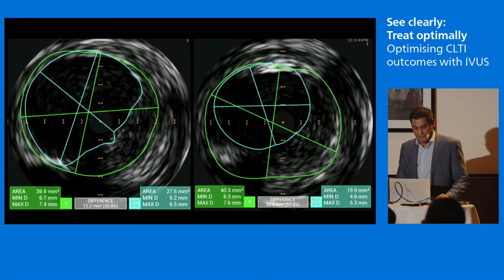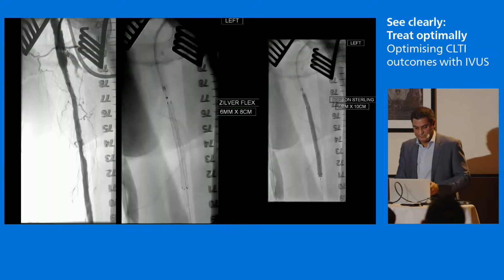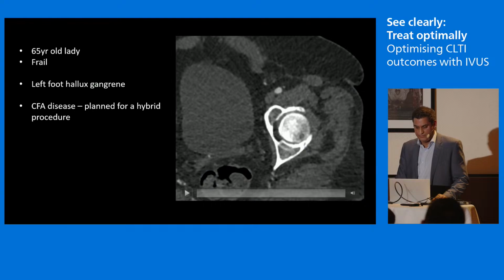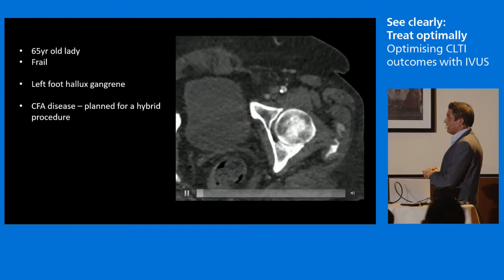I must be pressing something. Play that again. So here's her common femoral artery. So it's not me.